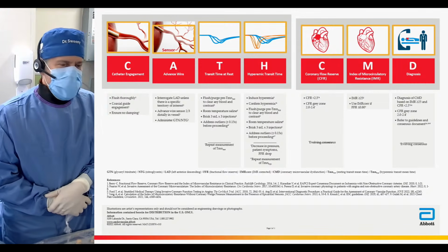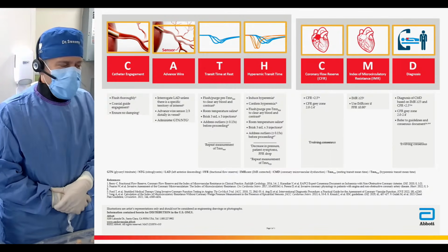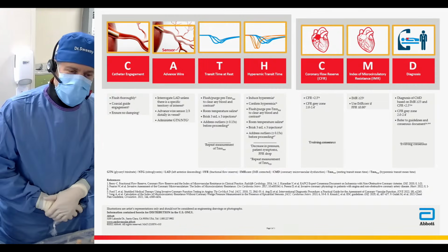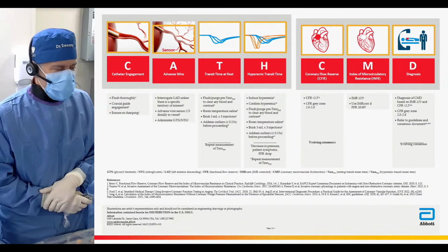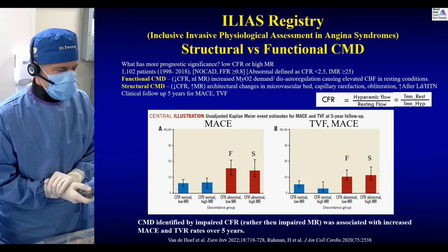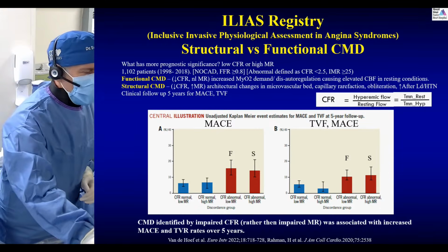You want to inject flows so they're consistent. You want to see the curves almost superimposable. And then you want to calculate the coronary flow reserve, or it does it for you, and the microvascular resistance, and then you come up with a diagnosis. So it's actually a nice slide that helps summarize really the overall scope of what we do with the adenosine testing in CoroFlow.